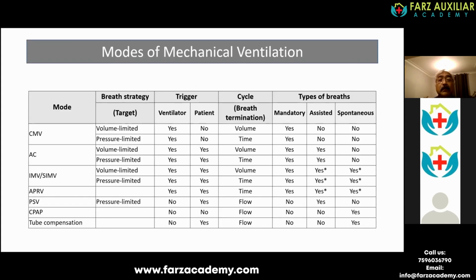So you can see this graph slide that basically we have a controlled mode of ventilation type, which can again be volume limited or pressure limited. And assist control mode, another control mode, where I'll explain what the difference is.